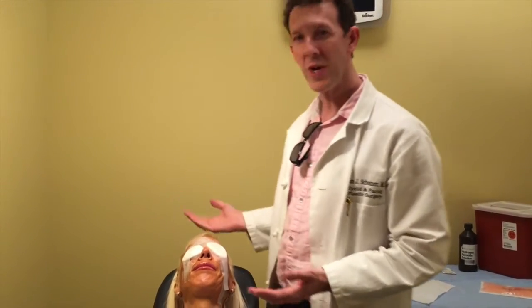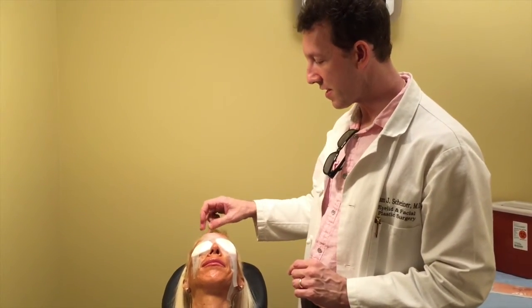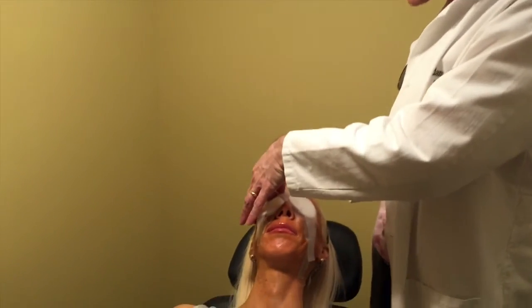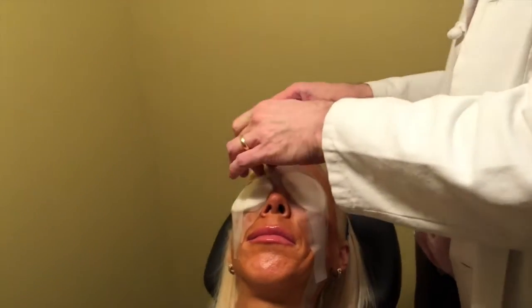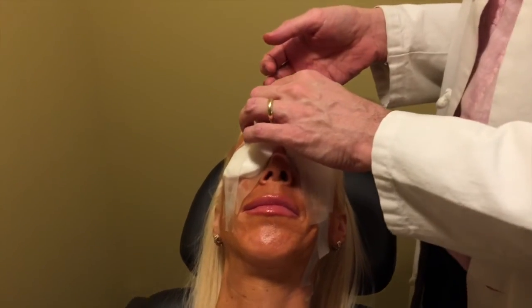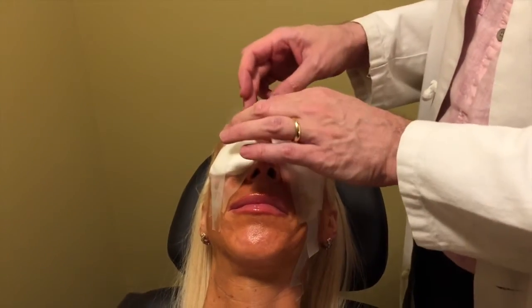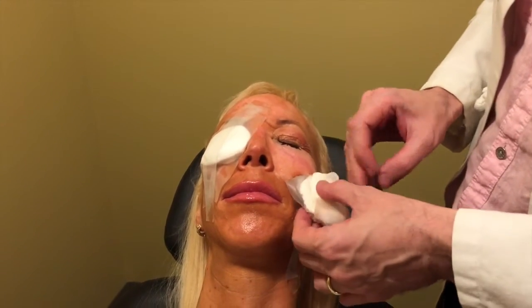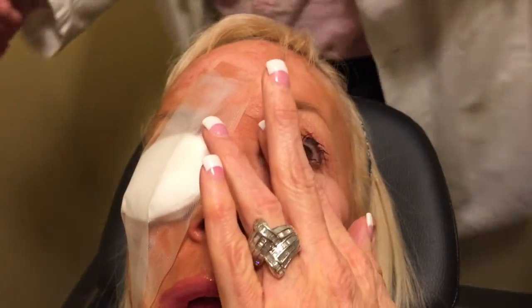Okay, so now it's been 20 minutes, and we're actually going to take off the bandages, and we'll see if there's been dissolution of the hyaluronic acid in the areas that we were trying to treat. I apologize, this can pull just a bit. So I knew this was the second side we did, so the way the tape lies. Sorry. And it looks amazing. Wow. Open your eyes for a second. That looks amazing. Fantastic.